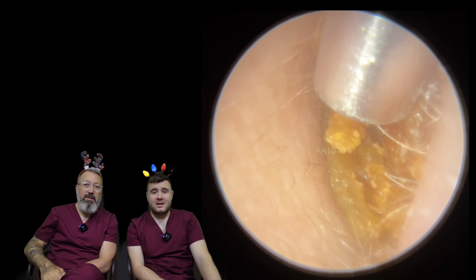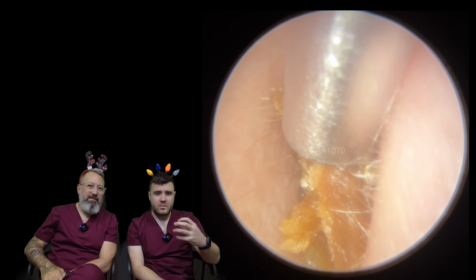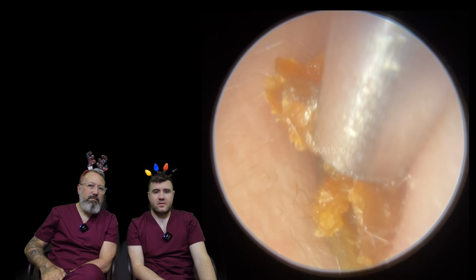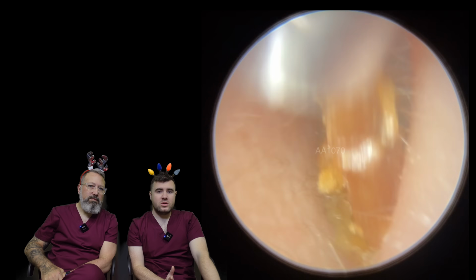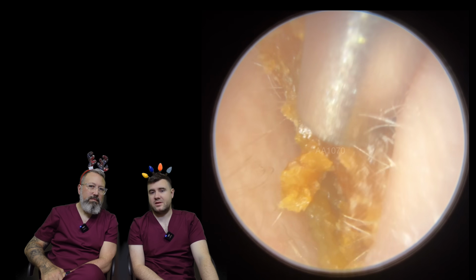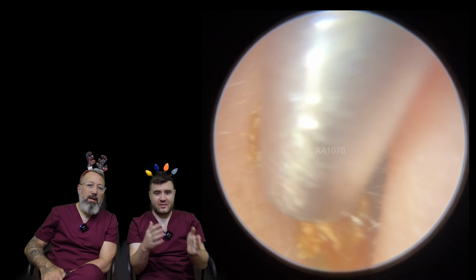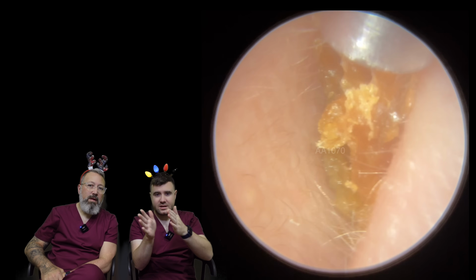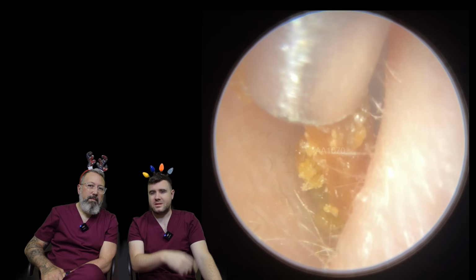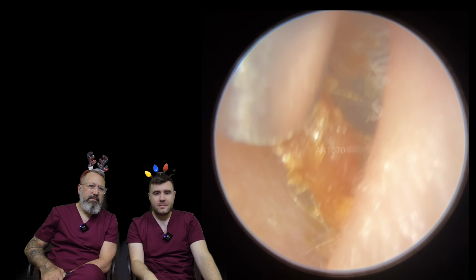It's coming away though. It's a narrow entrance, isn't it? Yeah, it's quite a long piece, so we're trying to draw it round the little bend in the ear. If you don't know, most people's ear canals, pretty much everyone's, but you get the occasional ear that's dead straight, will be in the shape of a letter S, so there'll be a couple of little curves in there. And it's quite tricky sometimes to get the drier pieces of wax around these little bends.